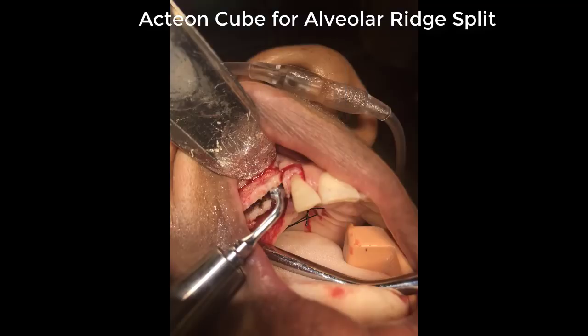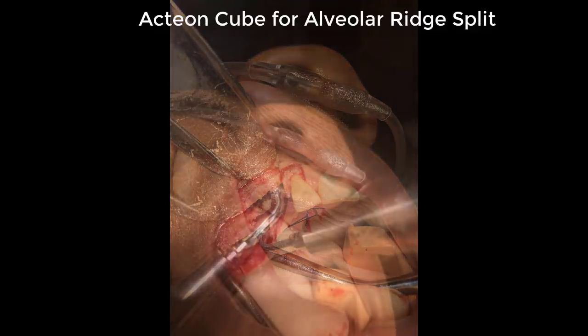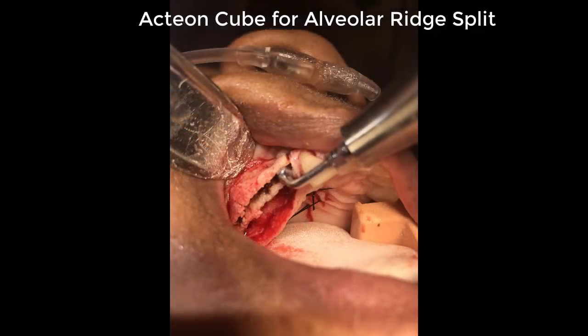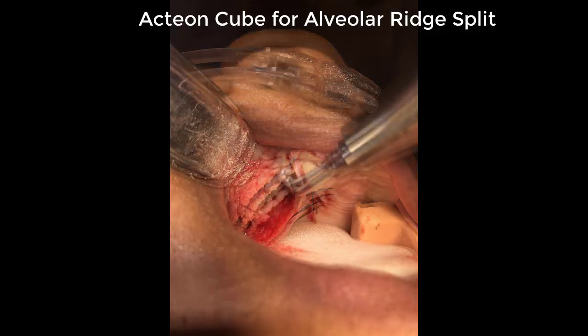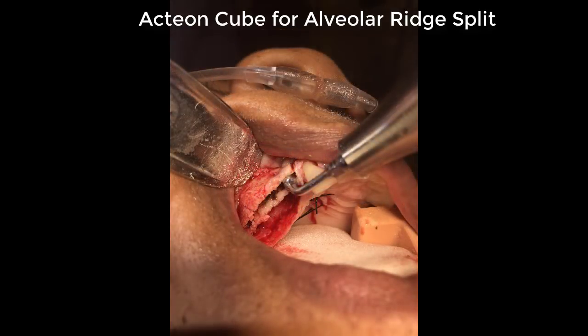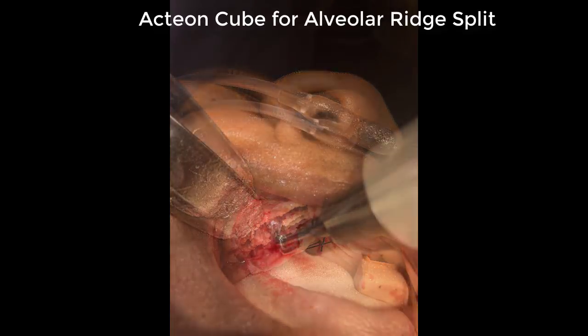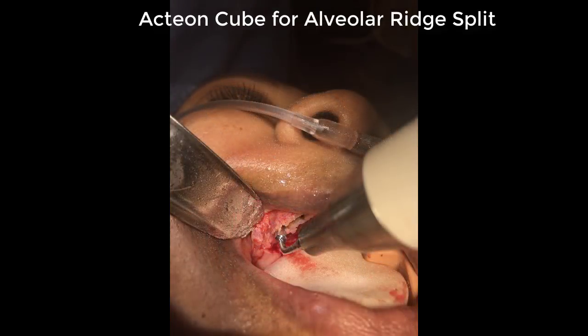We've also found the Piezotome Cube by Acteon very useful in other applications, including for alveolar ridge splits. The vast array of various tips allows us to make the appropriate selection for the procedure at hand, and we're using it for various other surgical procedures as well.